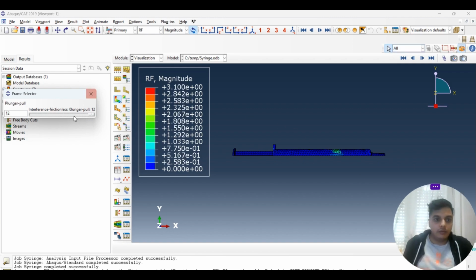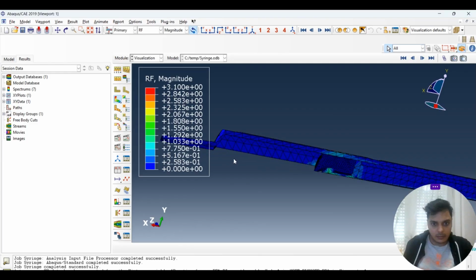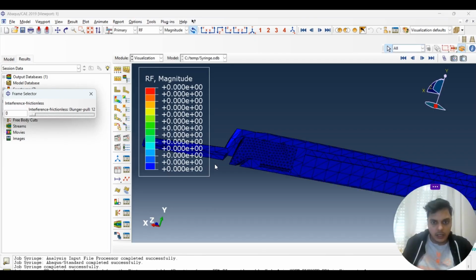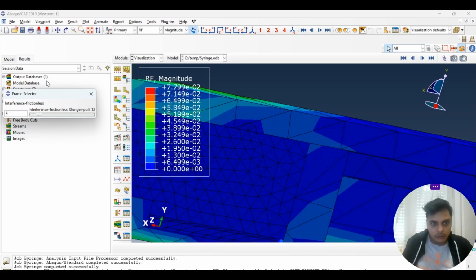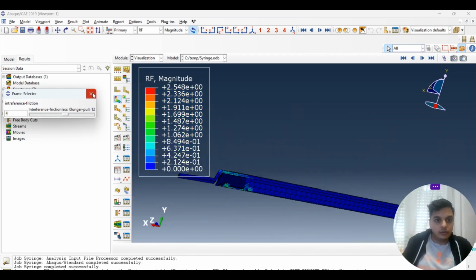If I tell you a bit more in detail what happened, initially it was trying to fix the interference, and then if I go more in detail, yeah, here it just compresses it and then it starts pulling it. So that's how this particular analysis goes, and we can check out the visualization.